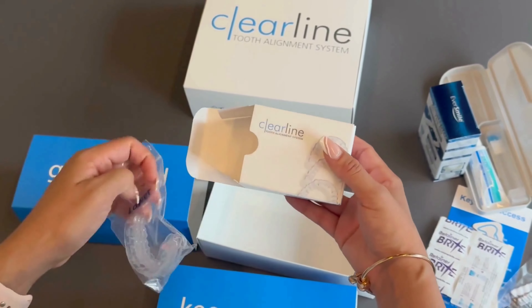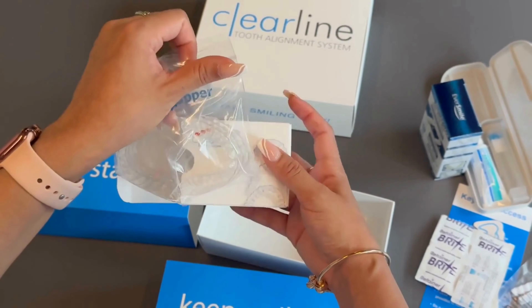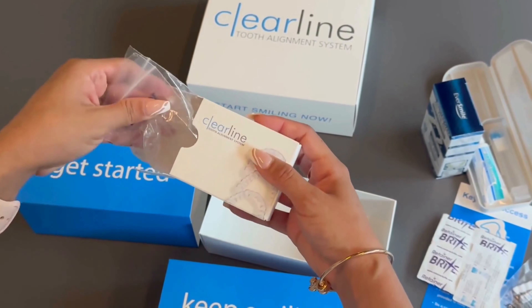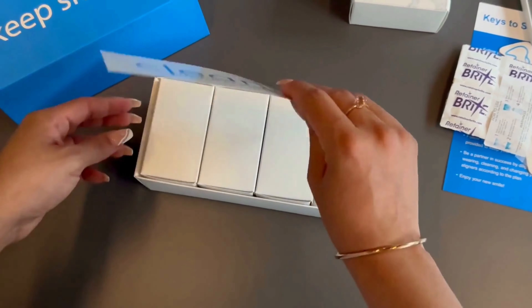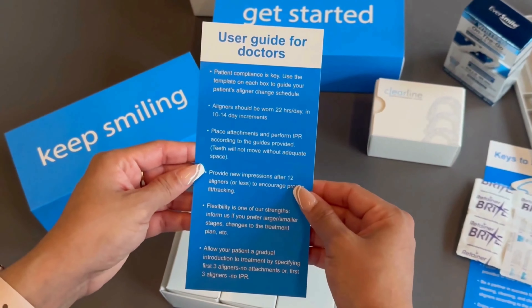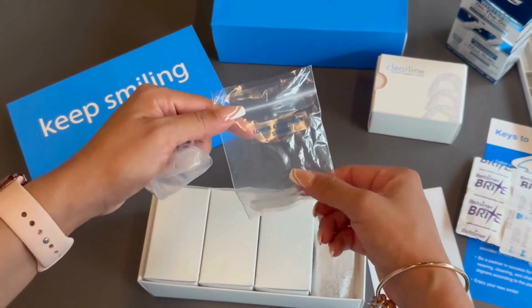This box contains both upper and lower aligners. Inside the Keep Smiling box, you will find instructions for the doctor, as well as the patient's models and stents to help with attachment placement.